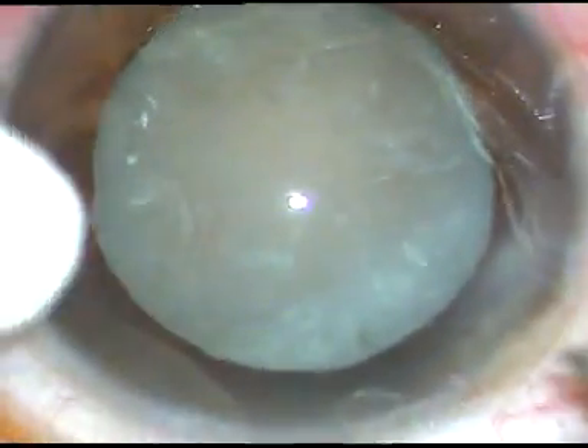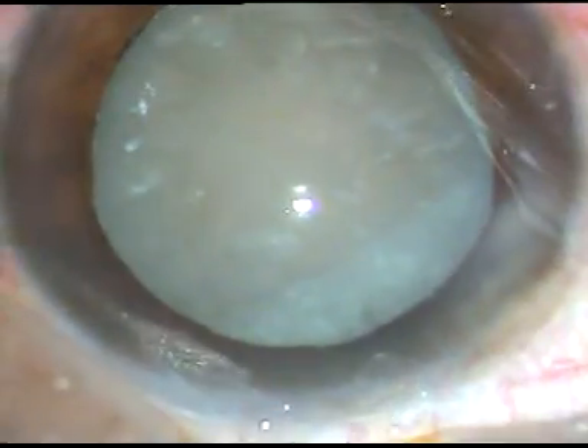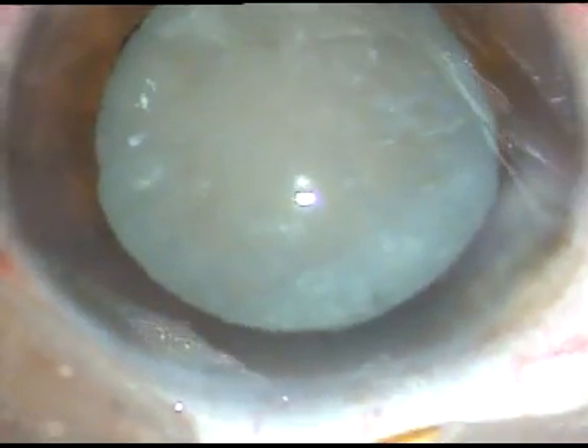Dear colleagues, this is a hypermature Morgagnian cataract. Let us see how the surgery proceeds.